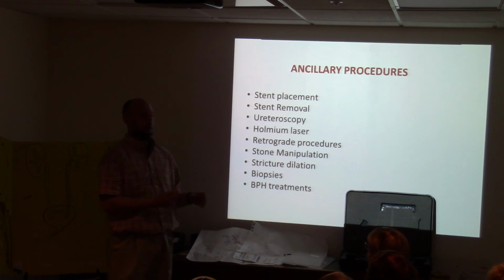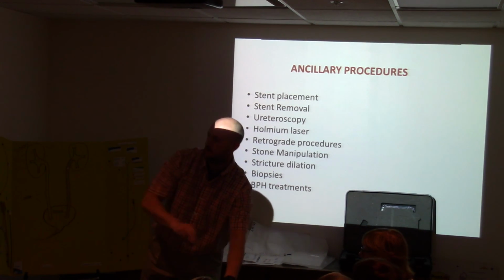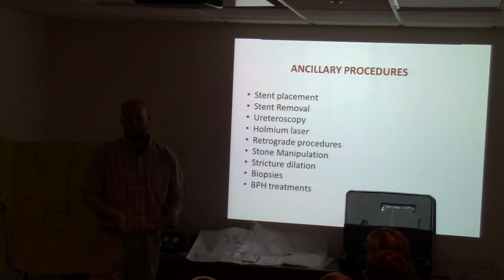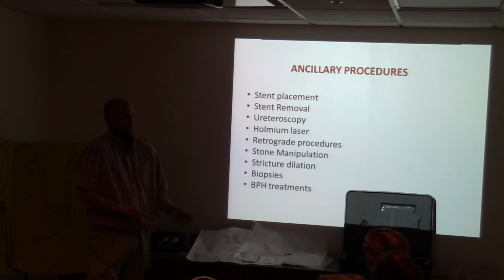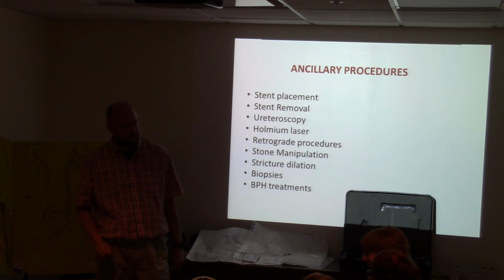A lot of times they use a video screen, so there's a camera system that fits on the back of the scope, and it's on the big screen TV, so everyone in the room can watch it. The younger guys love it because that's how they're trained. A lot of the older guys never use a camera. They're still down and dirty. I don't know why you'd want your head down there. Watch it on TV. But they like it.